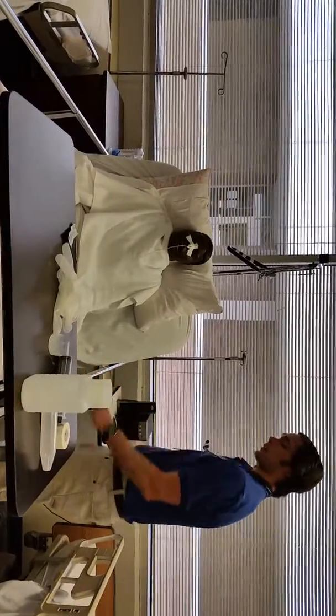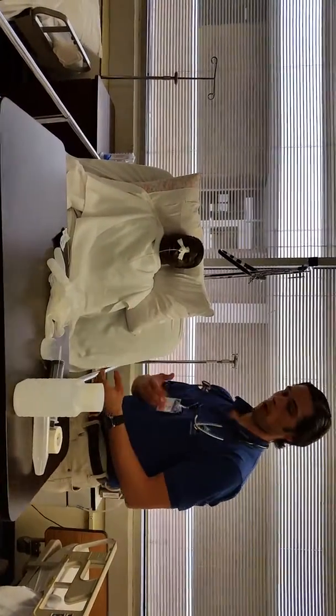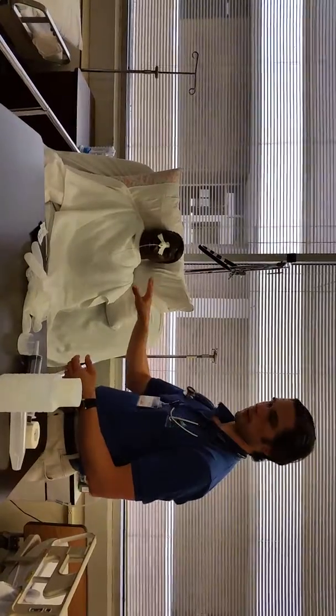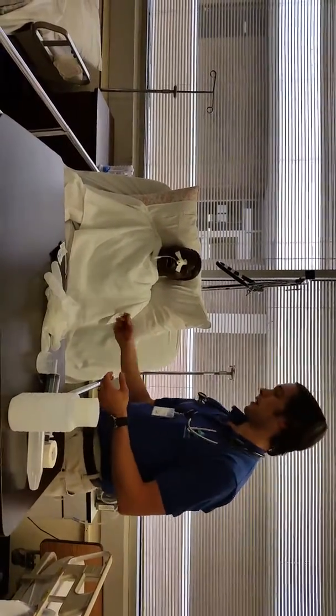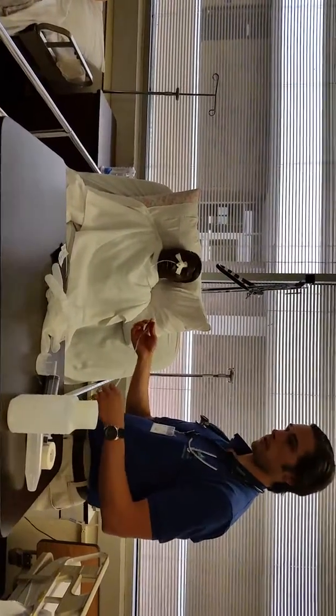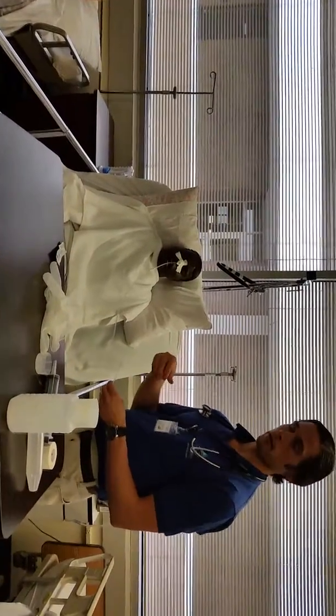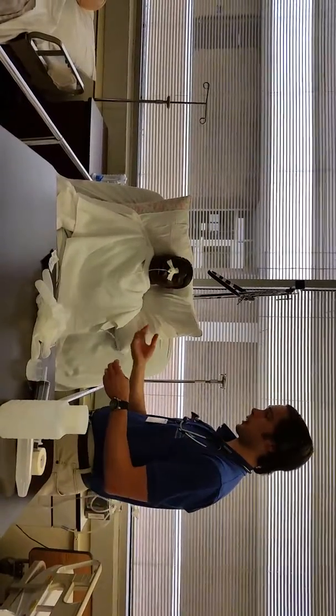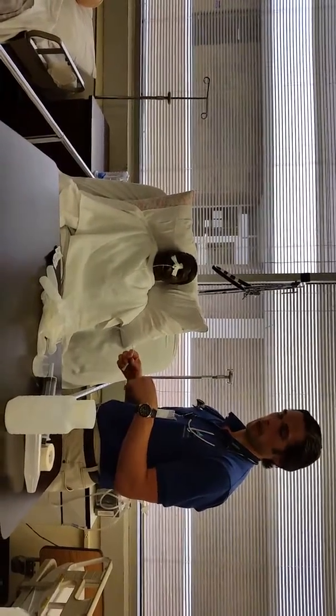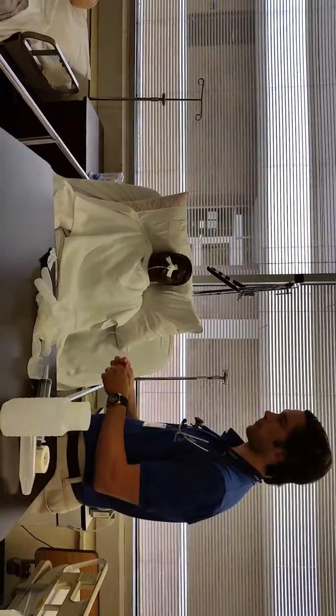When I'm done with that, I would document in the MAR, make sure they're tolerating this okay, but I would document the time, the length, the size of the actual NG tube, the color and consistency of what we aspirated, and the patient teaching, and then the input and output, and that pH that we got earlier.